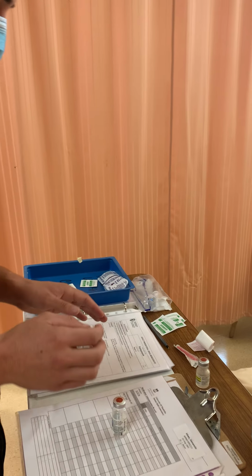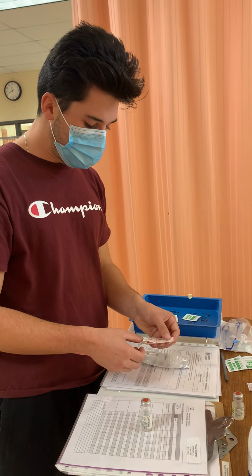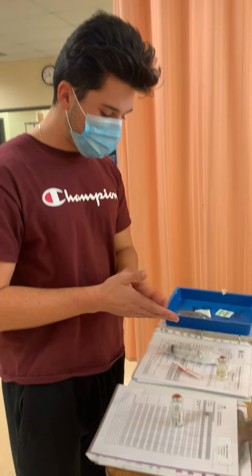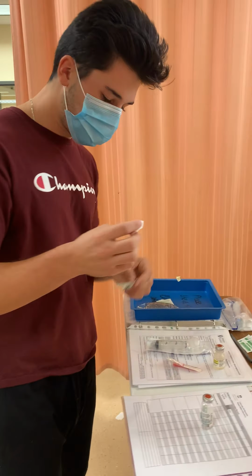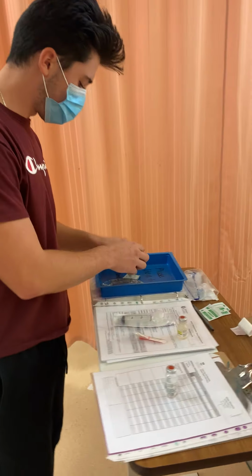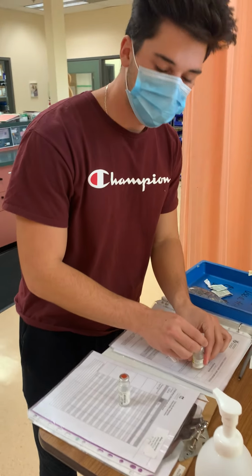Once I have looked at my PDM and done my first check, I can go ahead and grab all my supplies. I'm going to grab my syringe, my blunt fill needles, and my normal saline that I'm going to add. To start, I'm going to grab an alcohol swab and swab the top of the vial for 30 seconds, let dry for 15. Then I'm going to grab another alcohol swab for my normal saline, swab for 30 seconds, let dry for 15.